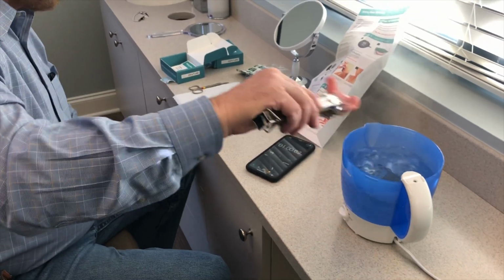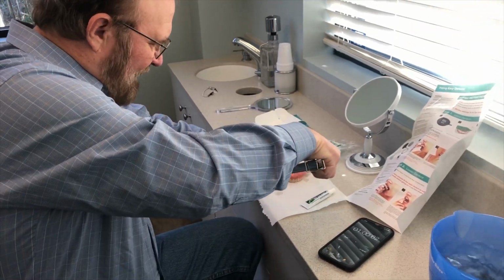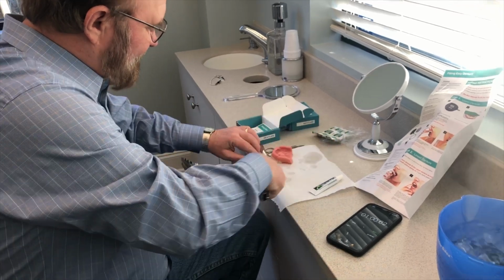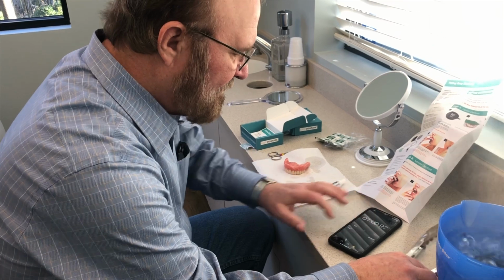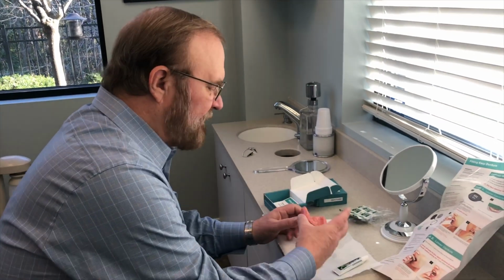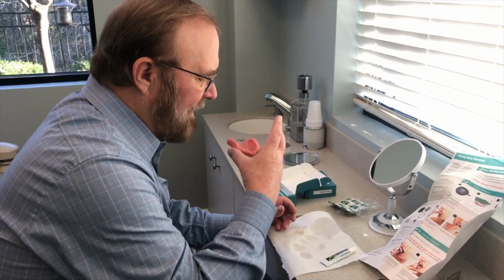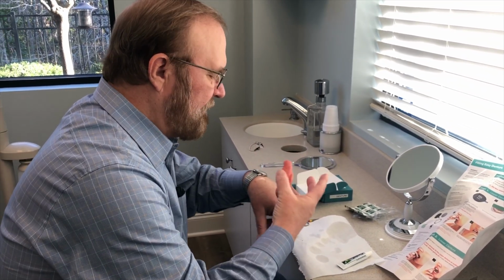Put it on the countertop, that's fine. A little toasty. Let it cool for about 60 seconds. Now it's just kind of manipulating it. It might be too hot for your mouth, so feel it on the back of your hand just to make sure it's not too hot.